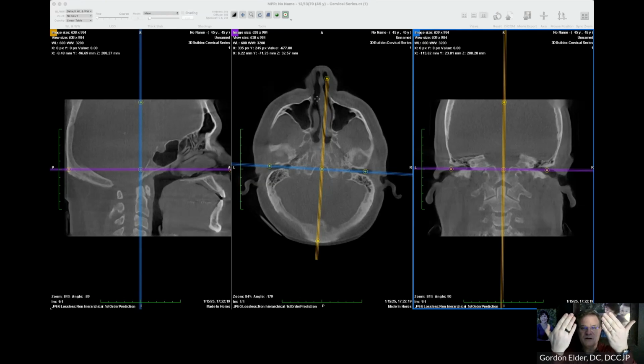And the primary motion of an ellipsoidal joint is to move forward along its long axis. Now you've got two of them paired, and they're not lined up in the same direction, so they're going to check each other. If they misalign, then you know there's a problem. They're made to check each other, but they check each other with soft tissue. It's the ligaments, the capsular ligaments around each joint. And so in an accident, in a trauma, they can be injured and they can go too far forward on the right side, which would make the left side move off of where it's supposed to be. That's where you would see the misalignment. Even the whole bone is misaligned with the bottom of the skull.